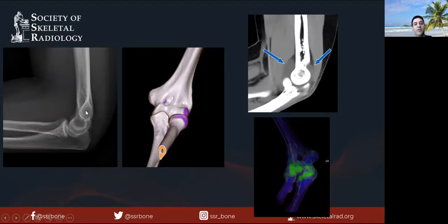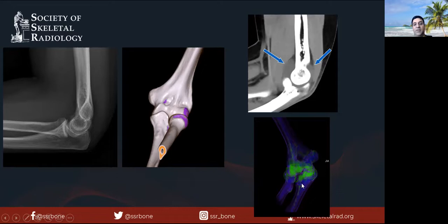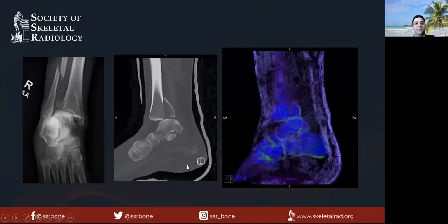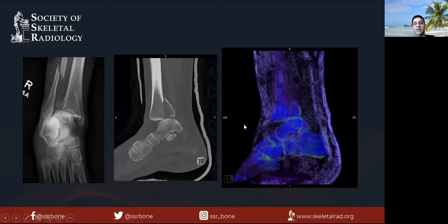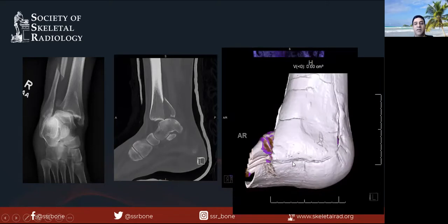In younger patients, when you see effusion you always think of radial head fracture or lateral condylar fracture. In this case there are no fractures despite a larger effusion, but there is bone marrow edema — caused by synovitis producing reactive edema from rheumatoid arthritis. There are pitfalls, however. Here you have bone fractures but no edema. Why? Because there's a cast — if you have a cast around the extremity, it attenuates the beam and makes it behave similarly to single energy, so you won't see that edema.